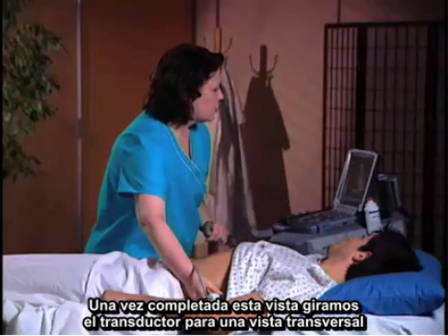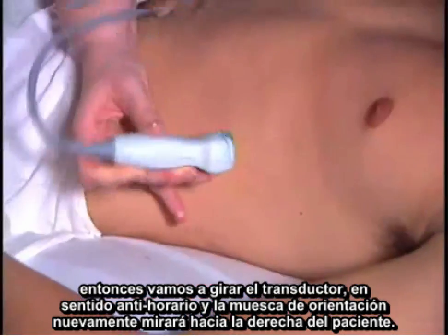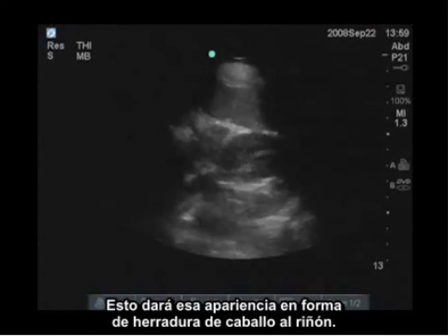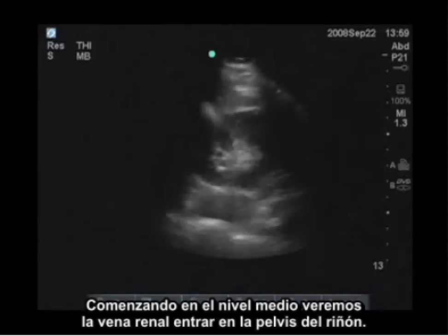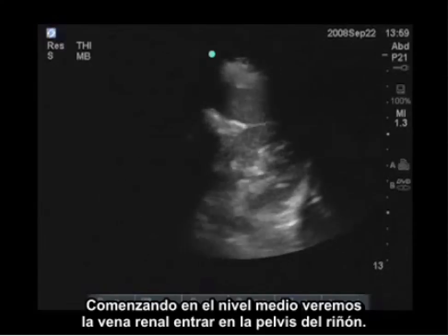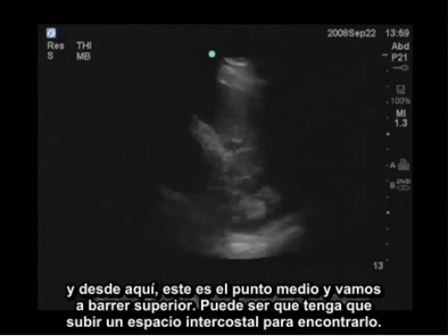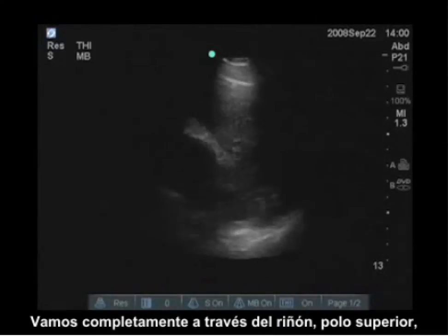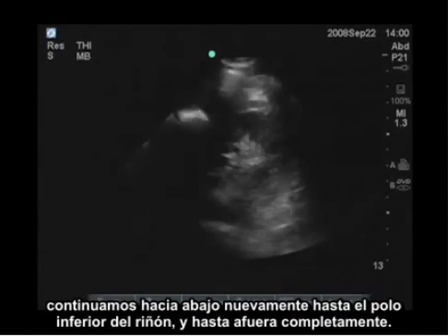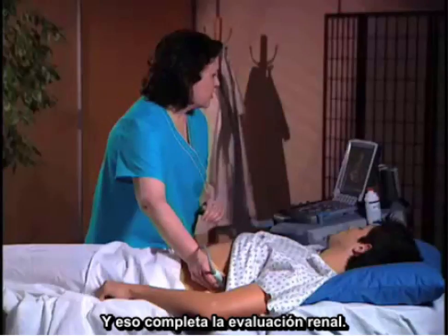Once I've completed this view, I'm going to turn the transducer to a transverse view — turning the transducer counter-clockwise — and the marker again will face the patient's right. This will give me that horseshoe-shaped appearance of the kidney. Starting at a mid-level, I will see the renal vein entering the pelvis of the kidney. From this midpoint, I'm going to sweep superiorly — I might have to go up a rib space to find it — go all the way through the kidney to the superior pole, then start to move inferiorly through mid-level and continue down to the inferior pole of the kidney and all the way out. That completes the kidney evaluation.